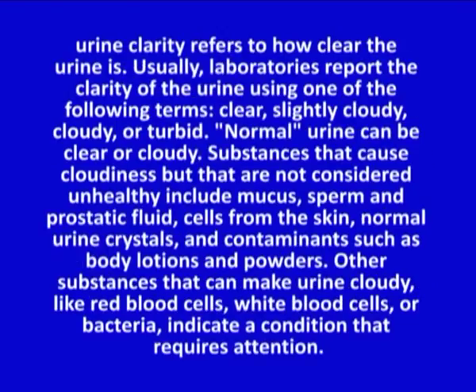Now, clarity. Urine clarity refers to how clear the urine is. Usually, laboratories report the clarity of urine using one of the following terms: clear, slightly cloudy, cloudy or turbid. Normal urine can be clear or cloudy. Substances that cause cloudiness but that are not considered unhealthy include mucus, sperm, and prostatic fluid, cells from the skin, normal urine crystals, and contaminants such as body lotions and powders.